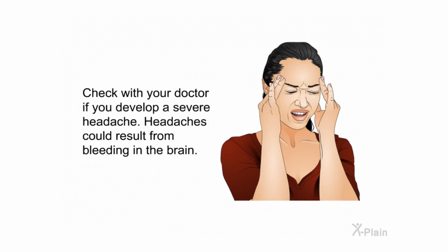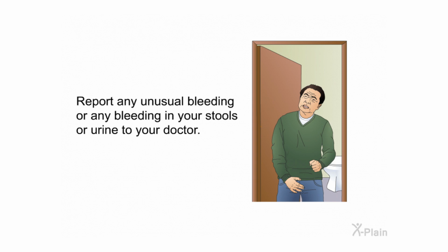Check with your doctor if you develop a severe headache. Headaches could result from bleeding in the brain. Report any unusual bleeding or any bleeding in your stools or urine to your doctor.